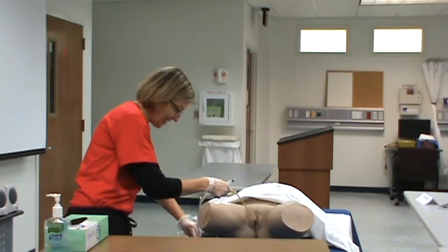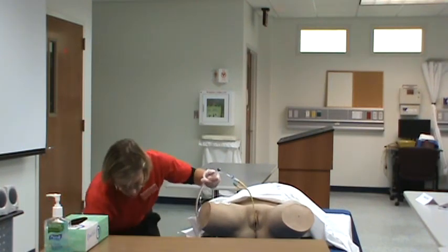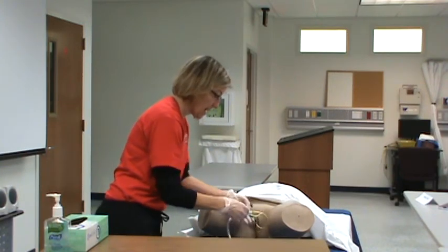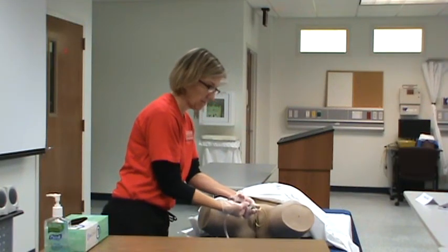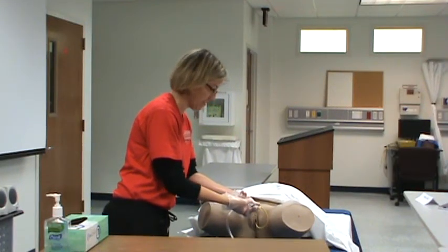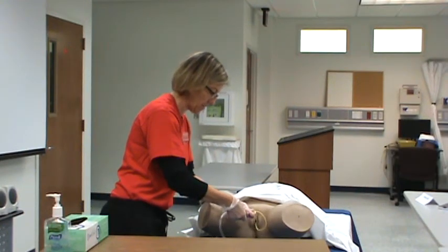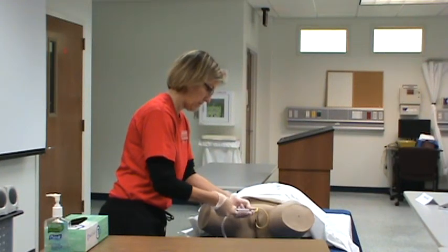And unclip the part that's been clipped to the sheet and then take it off and I just kind of put it in between our legs. And then I connect, and even this one you can see uninflates itself. And so I can just kind of hold it there and it'll do that. And all the commercial ones that we use at all of the facilities kind of do it on their own as well. But I want to move the show along, so I'm going to help it.